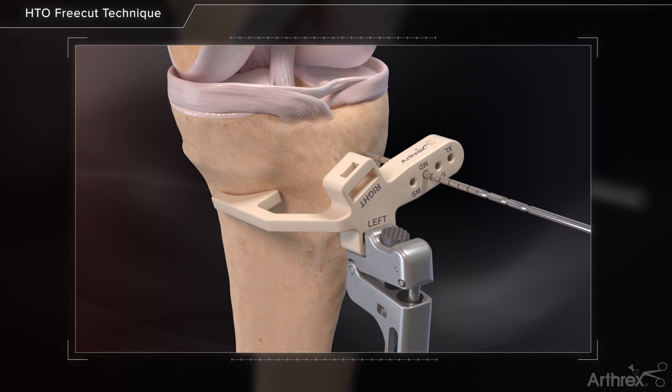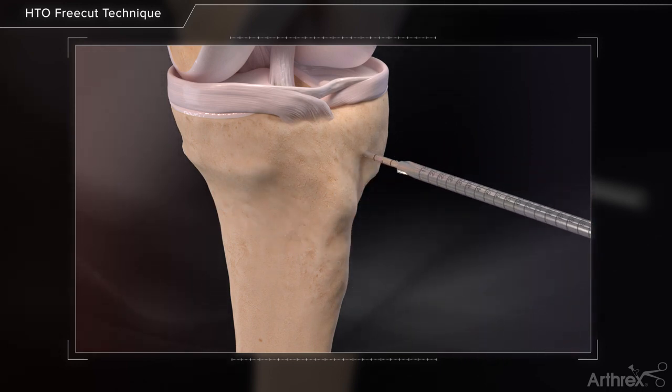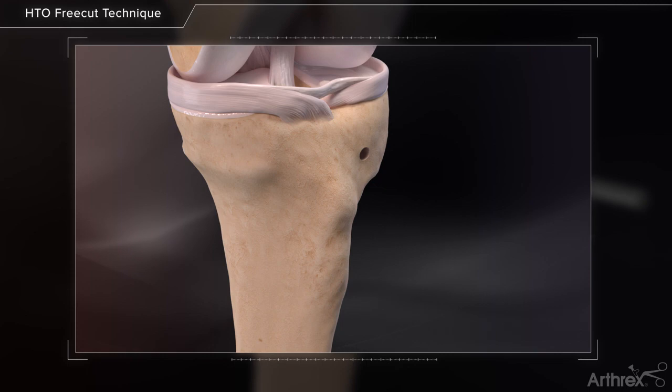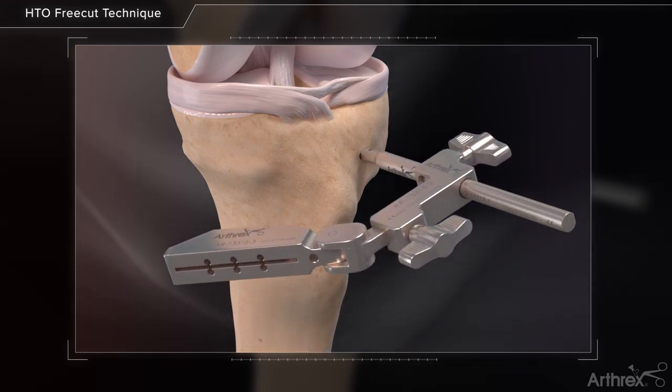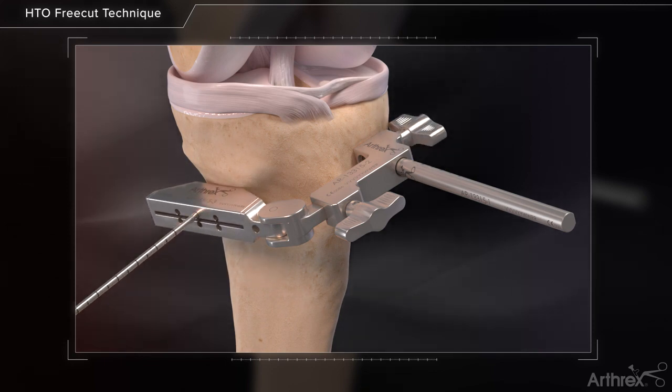A single guide wire is driven into the predetermined size hole. The guide wire is then over-reamed with a 5 mm reamer, and the hinge pin is inserted fully. In this variation of the technique, the hinged cutting guide is used. Position the guide wires based on the hinge pin location.